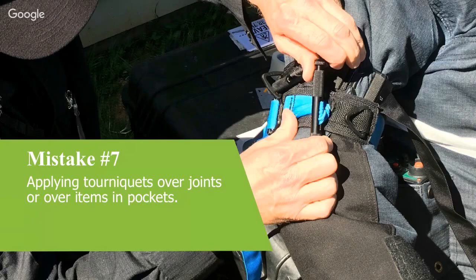Dan, anything to add? Yeah, no, good points there. Interestingly, there was recently an article published in the Journal of Special Operations Medicine, JSOM. If any in the audience aren't aware of that, have a look at it, definitely get on board with that. Yeah, get a subscription there. It covers a lot of great stuff that's relevant. If you're interested in this audience, then you'll be interested in that. Looking at the use with the US Special Forces issue CBRN suit, the Joint Service Lightweight Integrated Suit Technology, they concluded that you can actually apply it over that. So we had a fail over our bomb suit, but you can actually apply it over that CBRN suit.